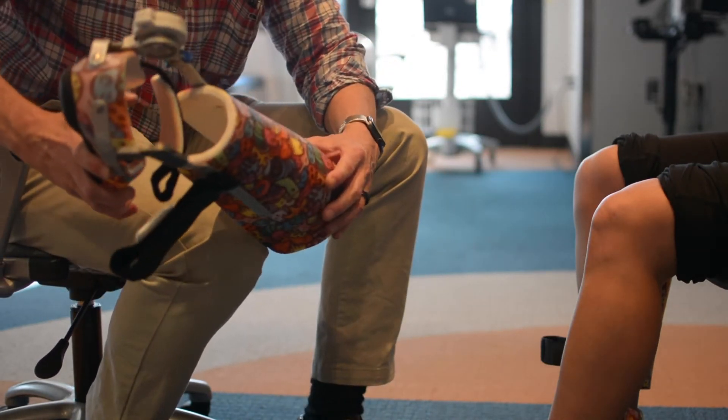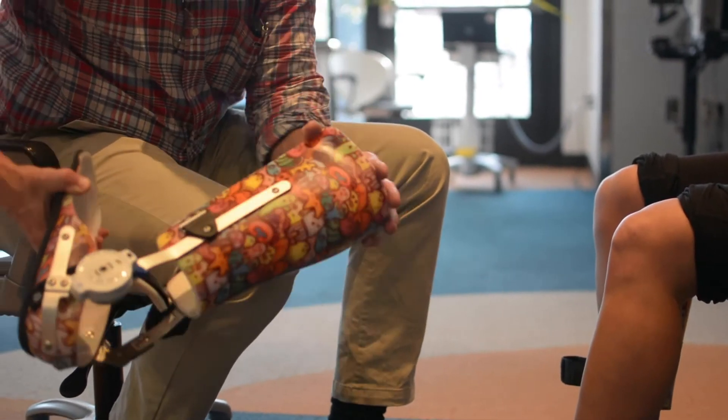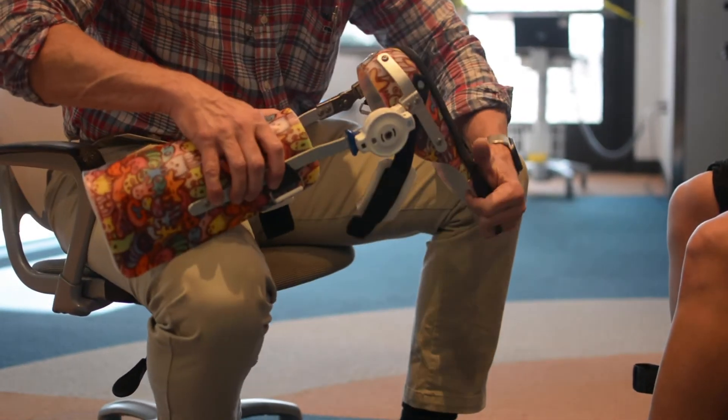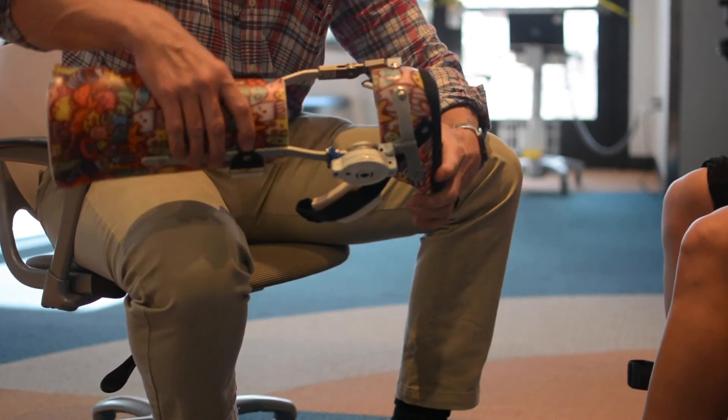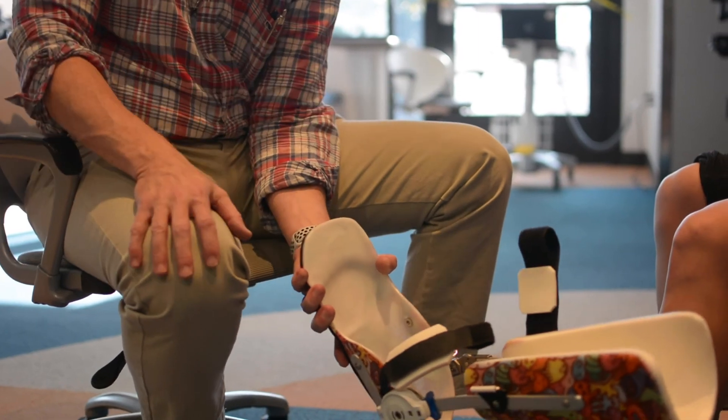I like to use my body like this — just bending the brace. I'll do it this way so you can see the actual lock. That way it frees up this hand so I can then lock it just like that. And now it's ready to go to do it again.